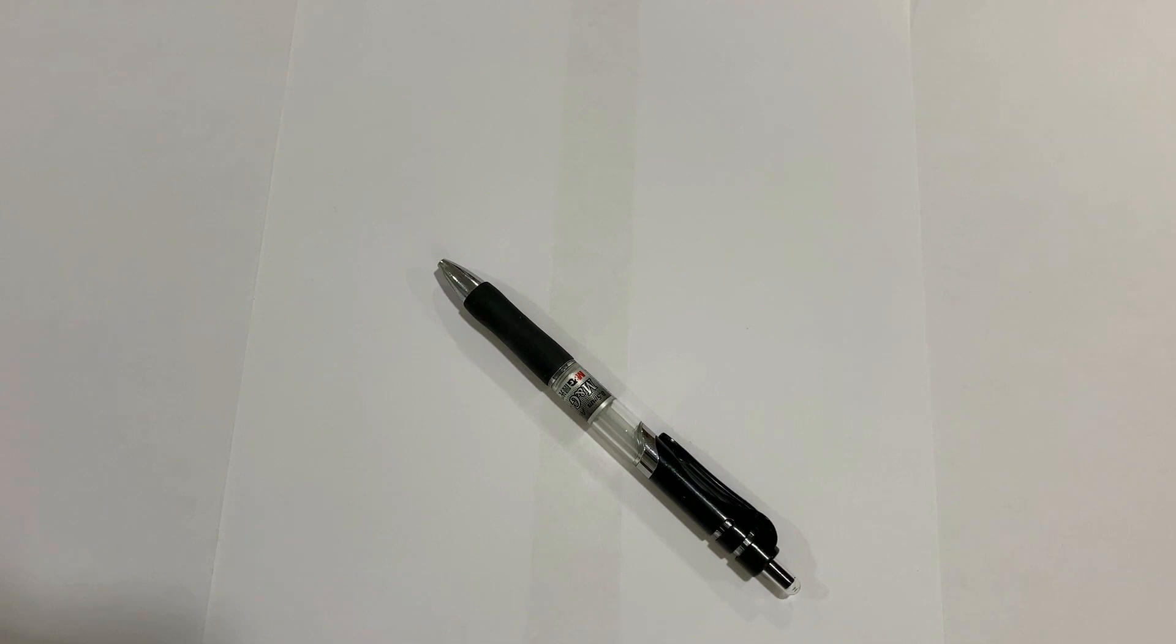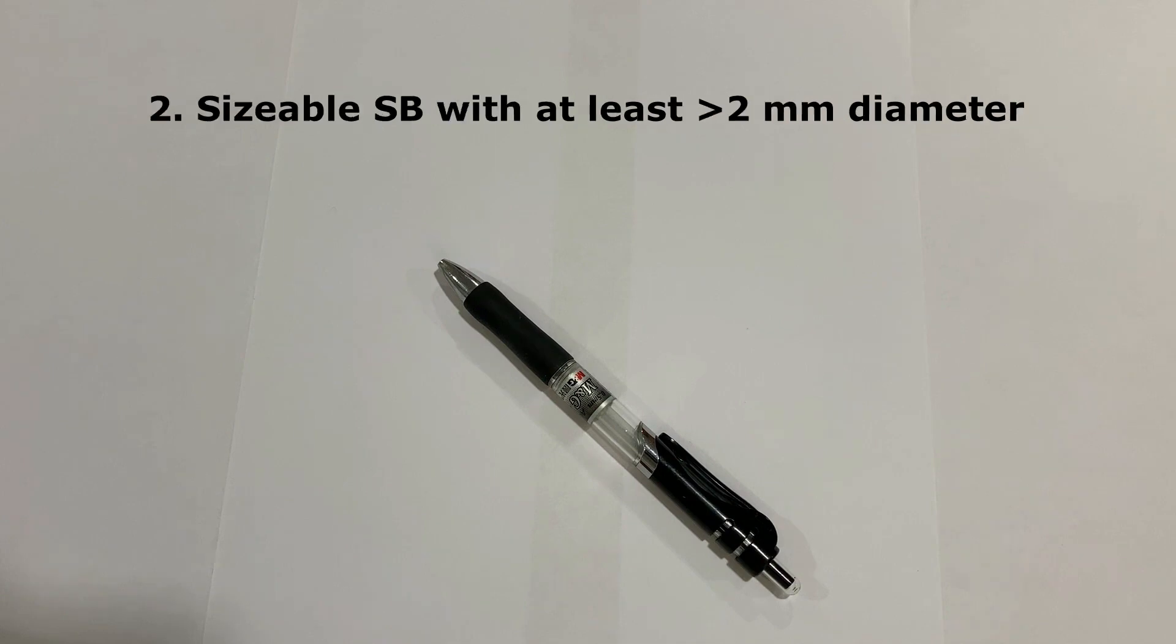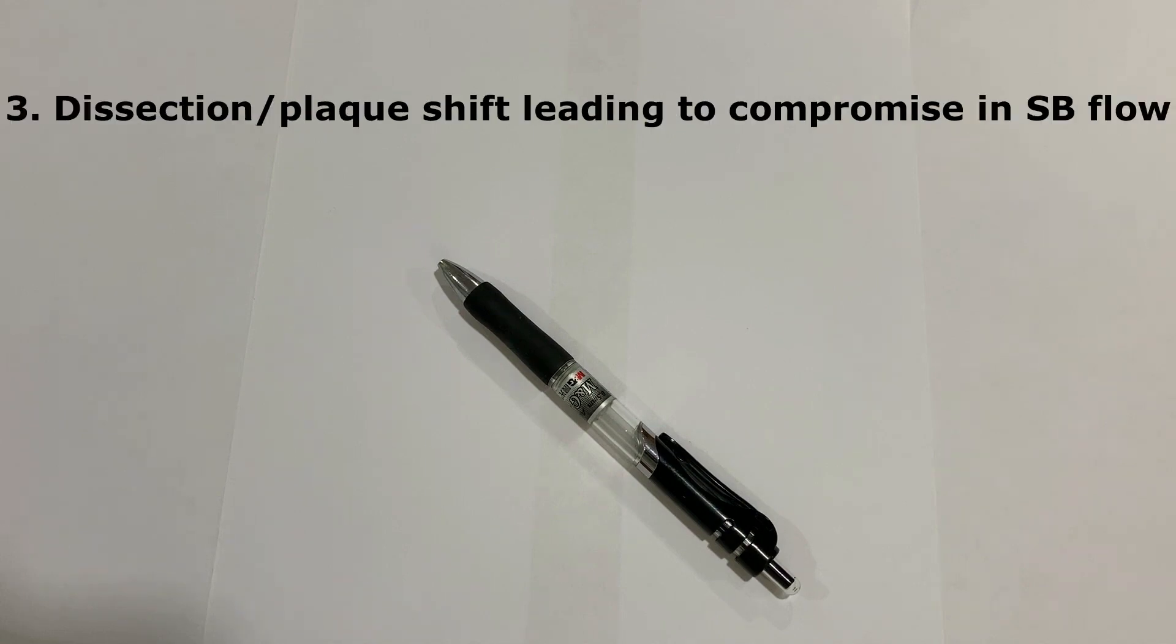First I should give you a background. There are three types of bifurcation lesions where one should start with planned two-stent technique. These are: visually or physiologically significant side branch lesion, significant diameter of the side branch lesion at least 2.5 millimeter or 2.25 millimeter, or dissection or plaque shift leading to flow compromise after pre-dilatation with balloon.